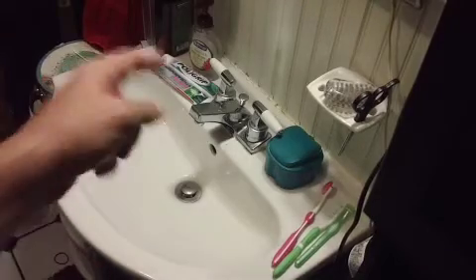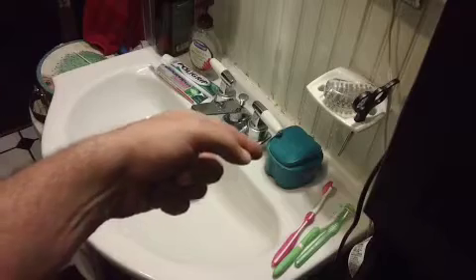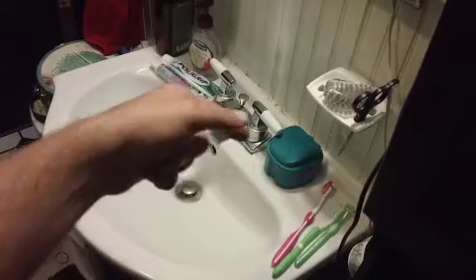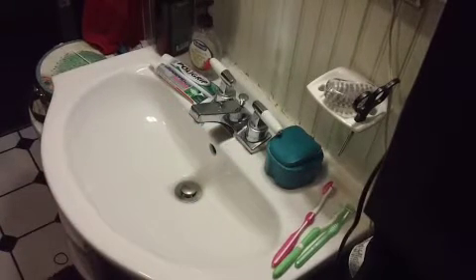Okay, so I've had my dentures out since last night. I took them out and put them in here with the hot water and the denture tablet, and they've been sitting there undisturbed overnight. So I'm going to open it up and show you kind of what I do.